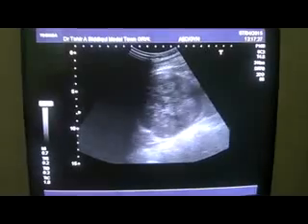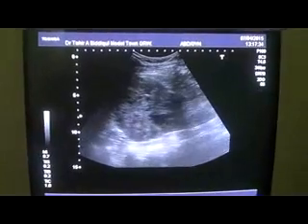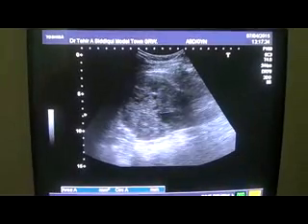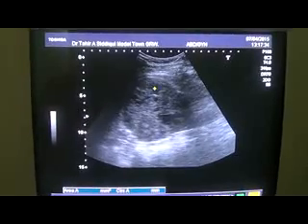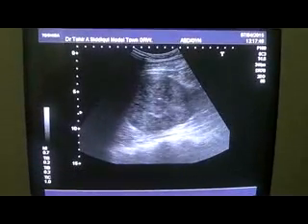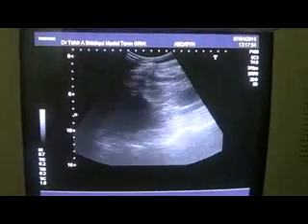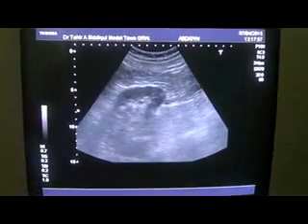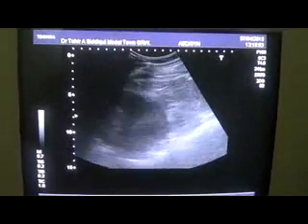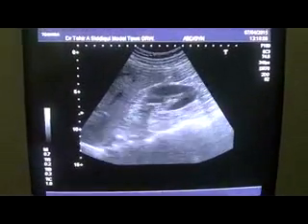Not only that, now it shows you a complex picture, cystic and solid. See, now you see these are the cystic areas. In fact, it is a solid mass, but with internal cystic areas spread within it. So a complex mass relating to the kidney, moving with the kidney. Now here you can see.